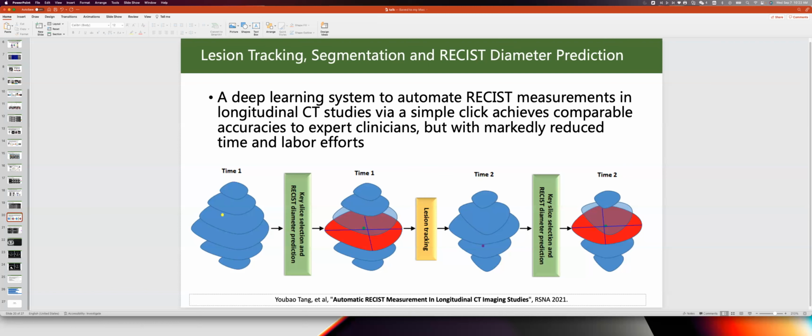So that's a real problem, because we train our models on one data set, but we deploy on a lot of data domains, maybe collected by different institutions. So there's a domain gap, and the performance also will have some gaps. How to deal with this problem? One solution is to fine-tune the models on that data to improve the performance. You have to collect some data and annotate some data, then fine-tune the models to make the gap smaller.